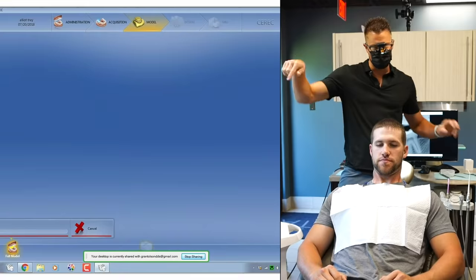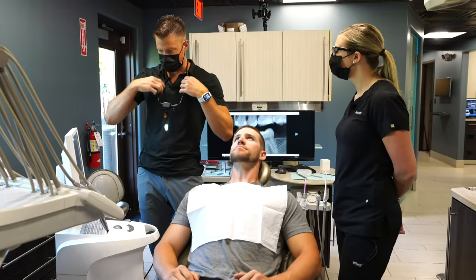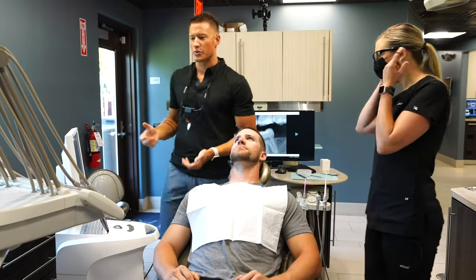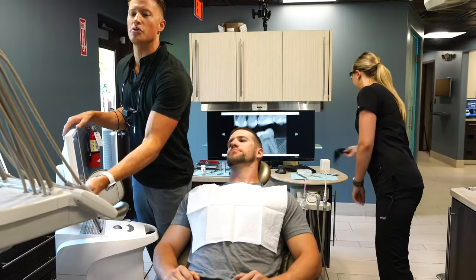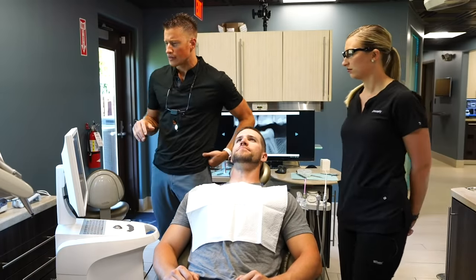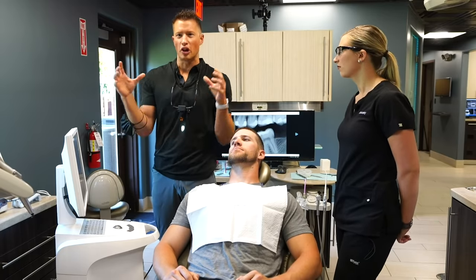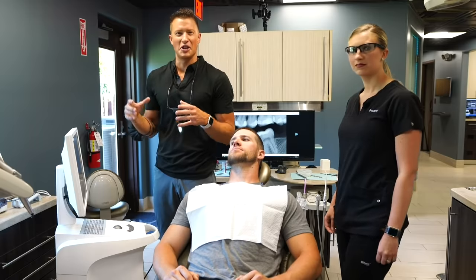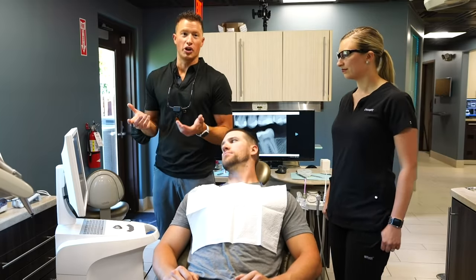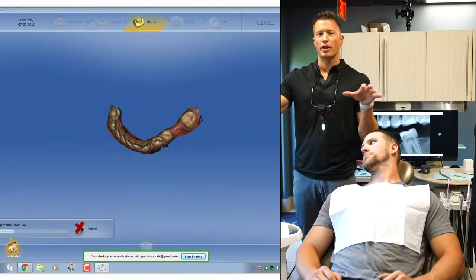Let me show the viewers here this plan where I'll show the design of that crown. It'll be rudimentary because we're obviously not making a crown. We're just going to use it for visual purposes so that way we place this implant correctly. I was just telling a gentleman earlier, this is going to be pretty cool and it'll all come together. You just kind of have to stick with me in the reasoning and the imaging and how they merge. For example, you're going to get to see an impression that we just took merge with a 3D x-ray.